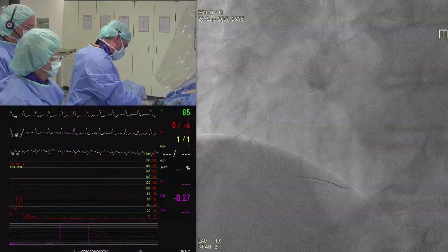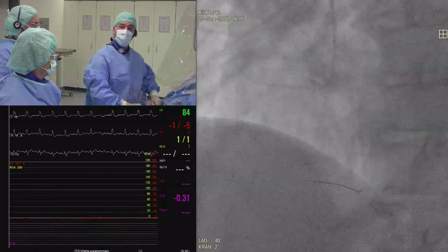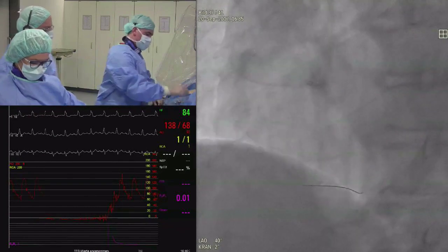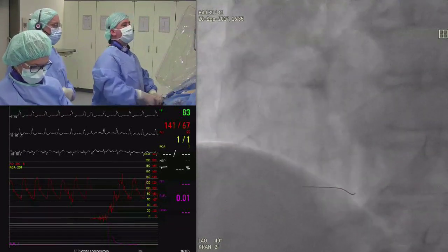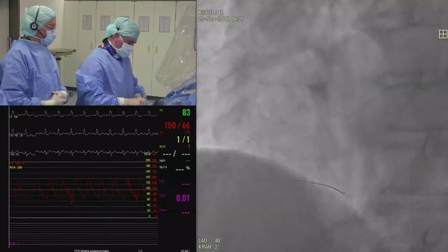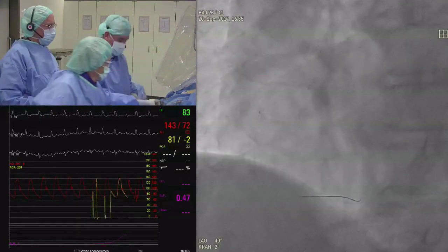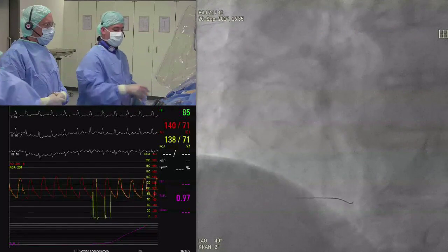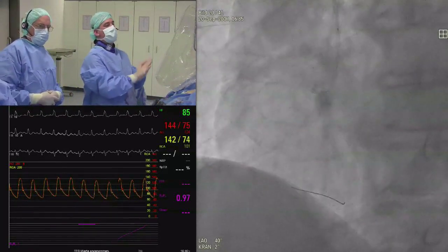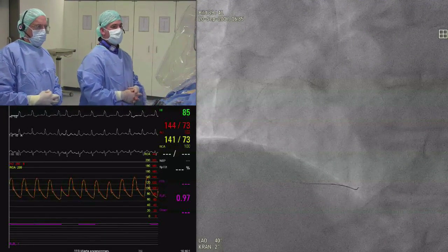2 millimeters more going distal or 2 millimeters more back proximal? Distal. Because I think we were trying to stay out of that distal bend. Okay. Since the physiology didn't seem to pick up much in that region. So back on the FFR track, can we start adenosine, please? So now this wire has been plugged and unplugged several times, and so far it seems to be holding true.